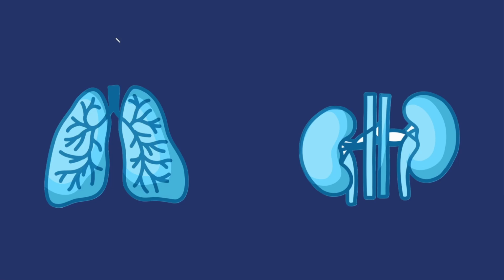All right, so let's talk blood gases. We have two types of blood gases that we could pull: the arterial blood gas, which comes from the arterial side, or the venous blood gas, which comes from the venous side. We'll go kind of in depth with everything, and then back up and learn the quick method that I still use on Post-it notes because it's nice and simple.